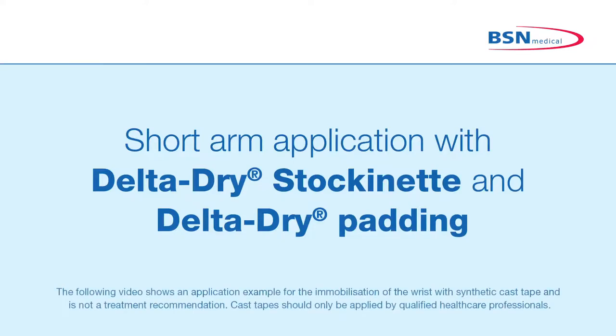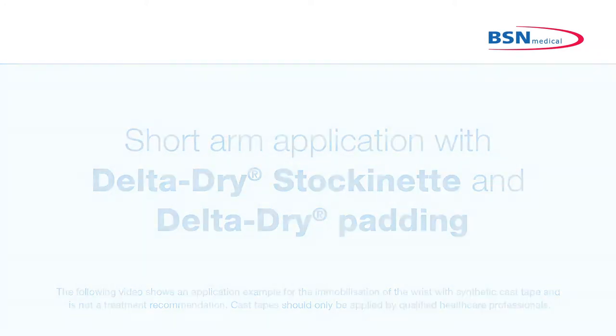Short arm application for indications where immobilization of the wrist is required, for example, distal fractures of radius and ulna.